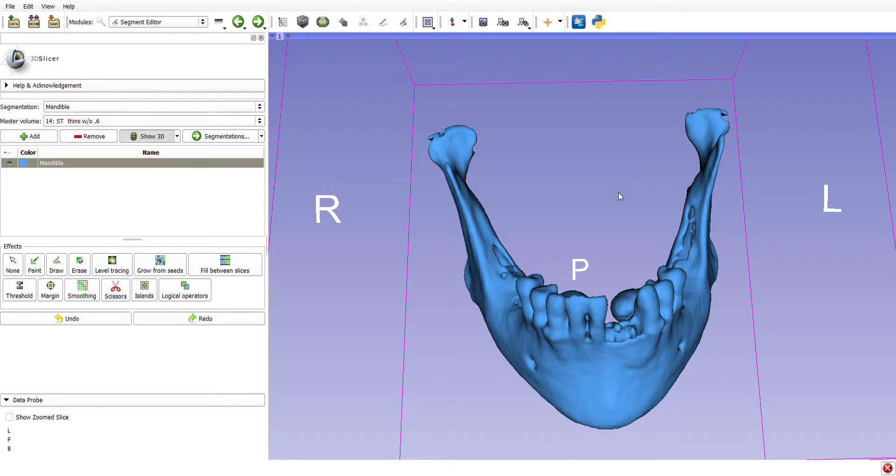In this video, I want to describe two common mandibular orthognathic procedures using Slicer software.